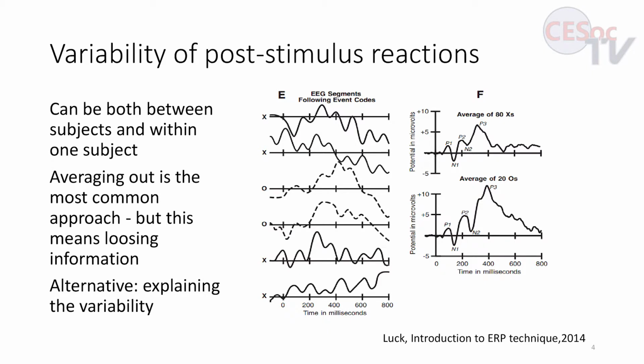And what is similar in all these measurements is a very high degree of variability, especially with EEG signal. You can look at different EEG segments, and the ones that are marked with X are periods of time following the same stimuli. And you can see how dramatically they are different. And it is very hard to work with this kind of signal. So people usually average out all these dramatic variation because it is assumed that well, everything else is noise and it will simply cancel out.